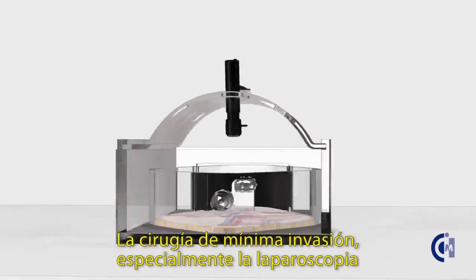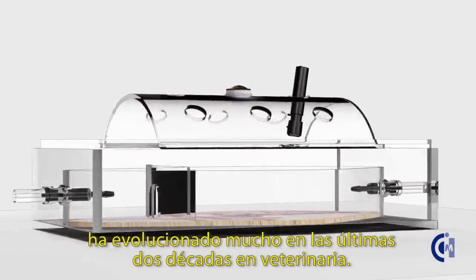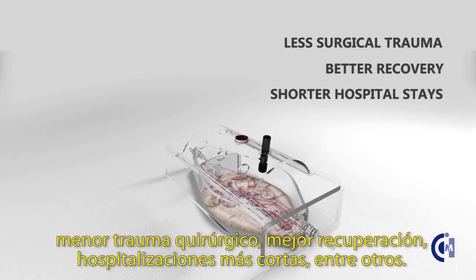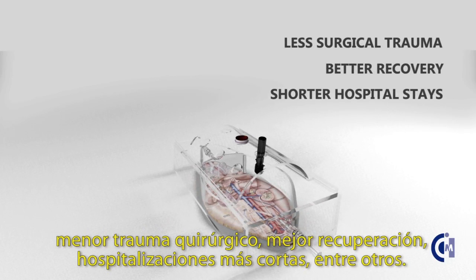Minimally invasive surgery, especially laparoscopy, has experienced great evolution in the last two decades in veterinary medicine. This fact is mainly due to its multiple benefits: less surgical trauma, better recovery, and shorter hospital stays, among others.